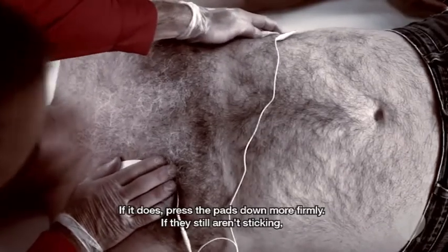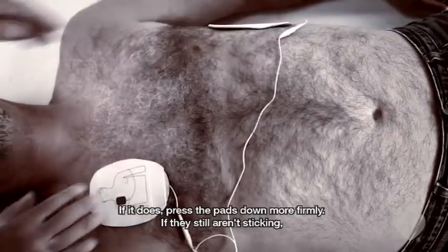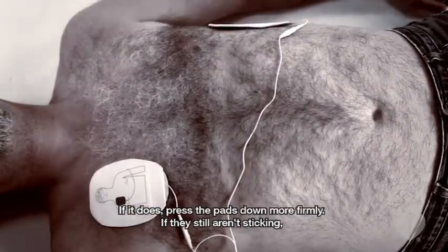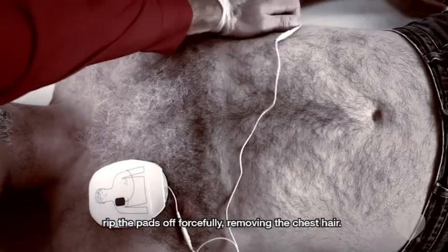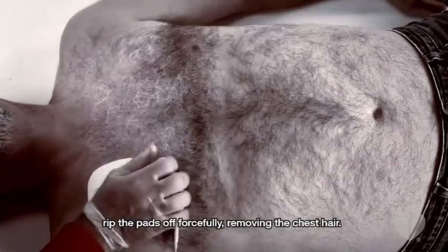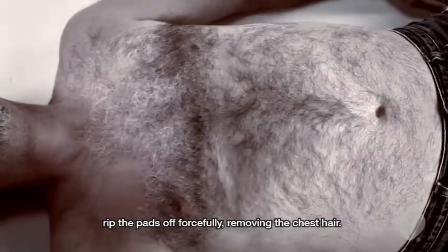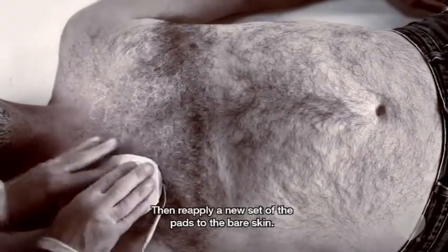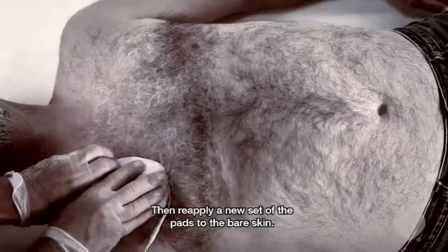If the AED tells you to check the pads, press the pads down more firmly. If they still aren't sticking, rip the pads off forcefully, removing the chest hair. Then reapply a new set of pads to the bare skin.